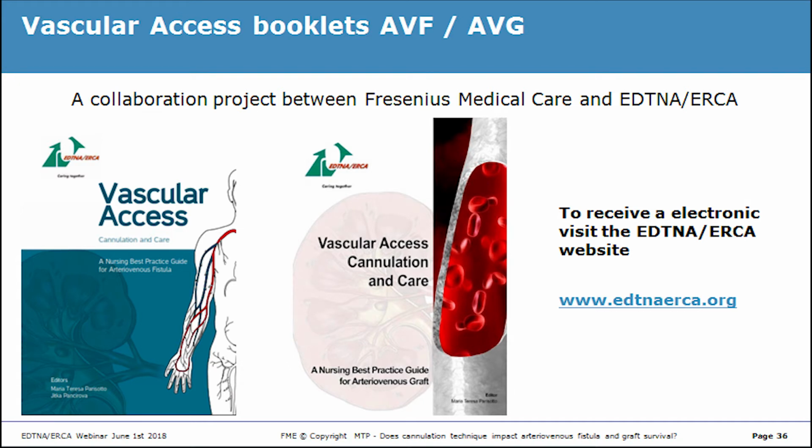Another question. Would you be able to explain differences between steel needle and Teflon in terms of AV longevity? I would like to, but unfortunately also in this case there are no studies. Well, it is not true. There are some studies, but with a small number of patients. Anyhow, there are fewer complications if you use the so-called Teflon needle or plastic cannula. It can be called in both ways.